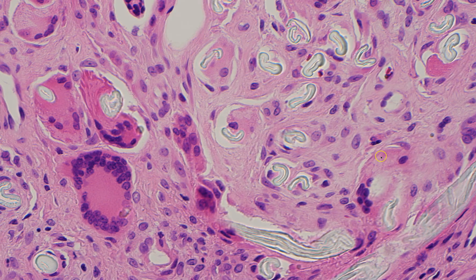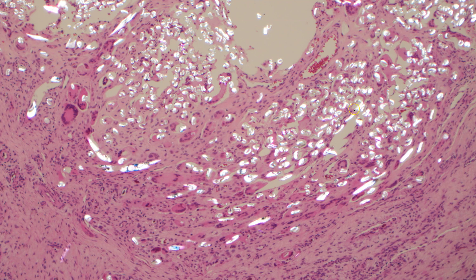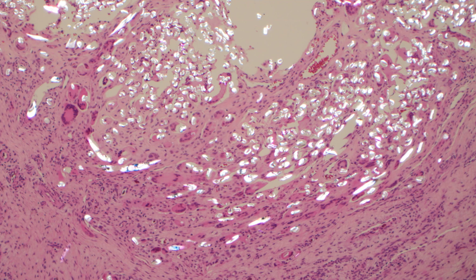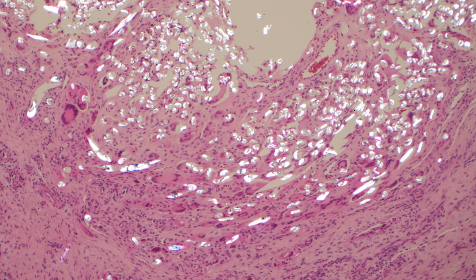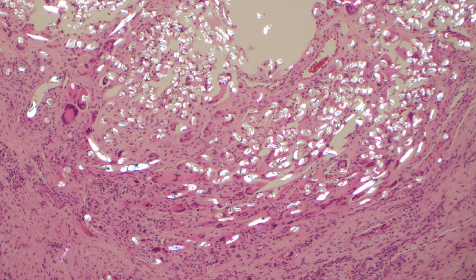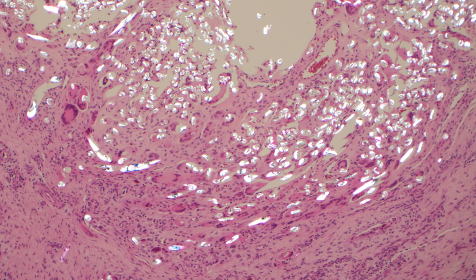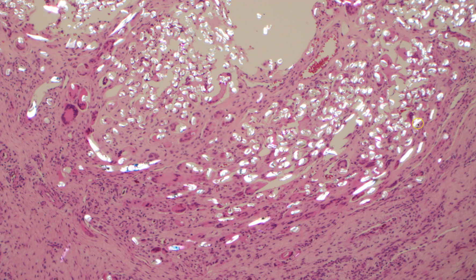Here are a few more pictures, even closer. And here's what it looks like if you put in two polarizable filters into the microscope and slowly rotate. It takes a little practice to adjust the light levels to capture this, especially if you have a microscope with auto exposure. If you're a pathologist trying to get pictures of polarized material and can't figure it out, turn off the automatic exposure on your camera, then manually adjust the exposure level and the way the polarizing filter is rotated. If you leave automatic exposure on, it'll just white out and won't let you capture this bright birefringence — it'll try to correct for it.